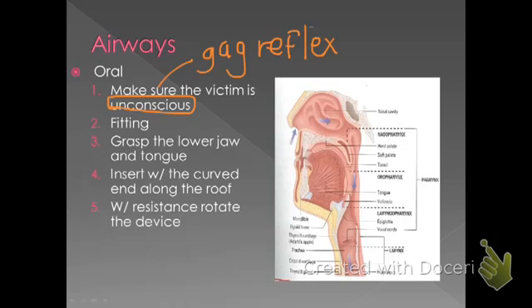We'll talk about fitting on the next slide, but it's very important that we have the appropriate oral airway. If not, we could induce vomiting even in our unconscious patients. So what we're going to basically do is grasp the lower jaw and tongue, and open up that airway.